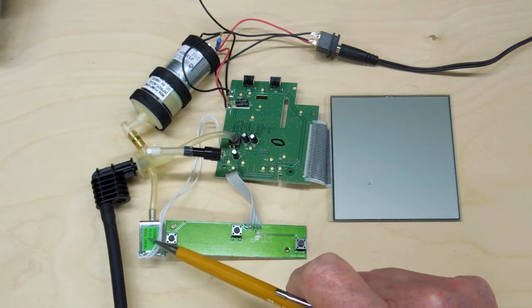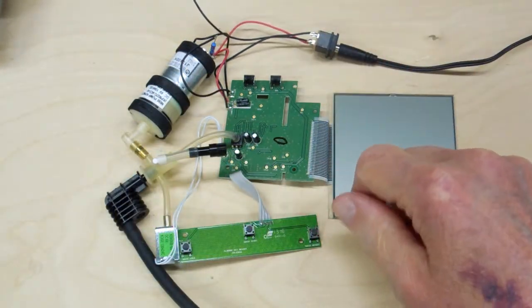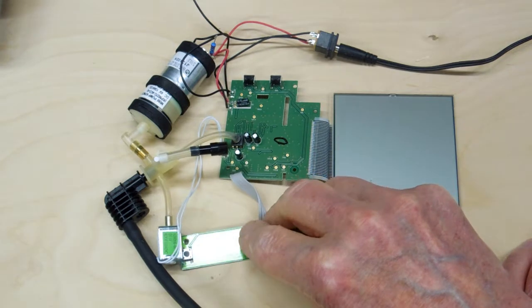This appears to be controlling the bleed-off. Every once in a while you can hear this thing click. We're plugged in now — this is 6 volts. Hit start.